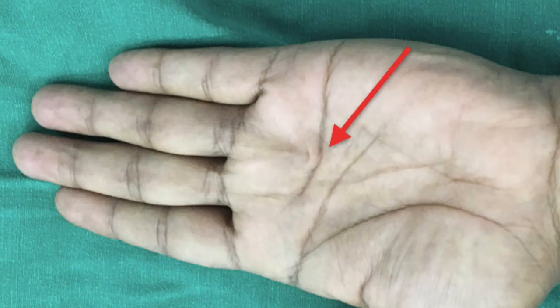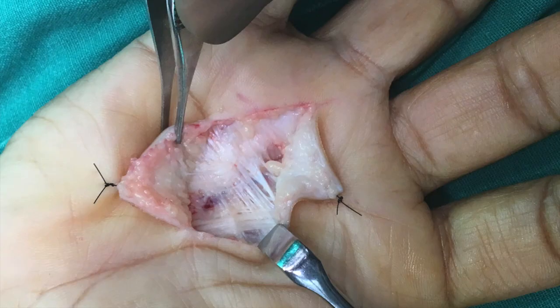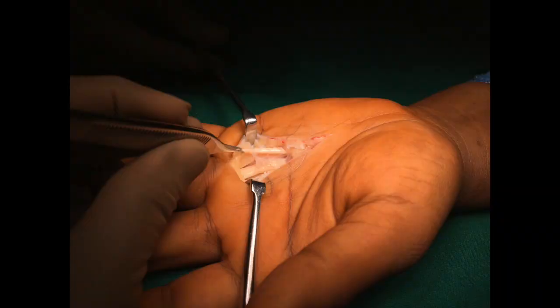Trigger digits may sometimes present with other conditions as well, like this one where the patient presented with a locked trigger with early Dupuytren's cords. In such cases, a vertical incision may be beneficial in addressing the pre-tendinous cords and excising them, along with the release of the A1 pulley.